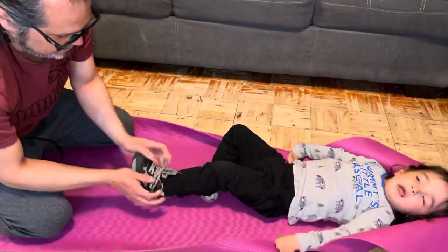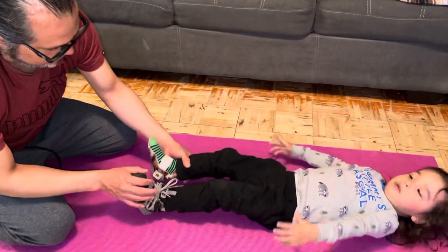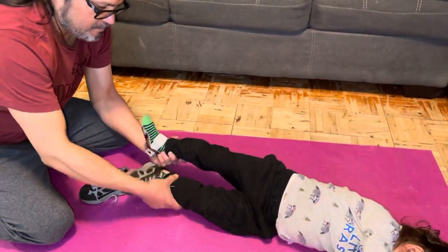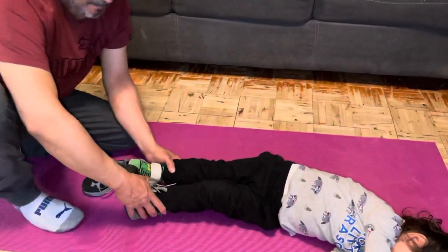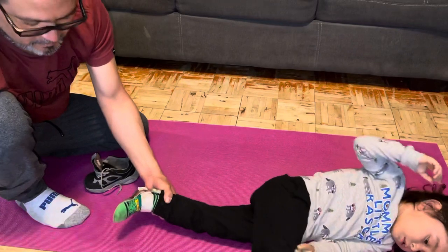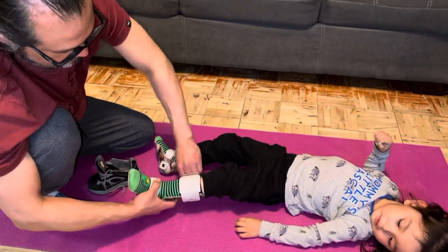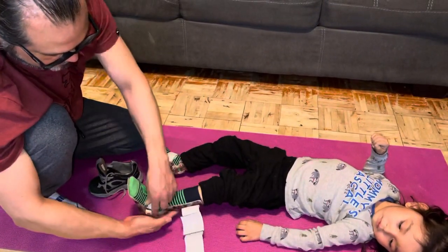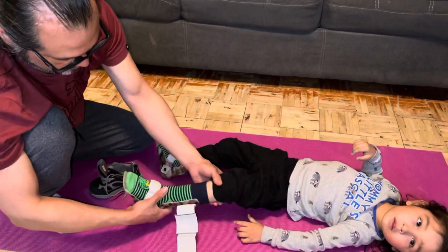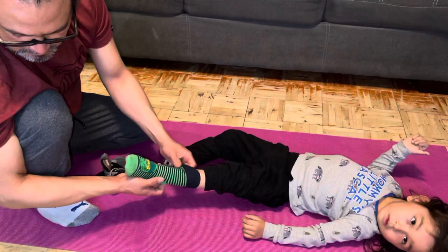Just like that, and that's it. I'll usually double knot it because he likes to pull on his laces. To take it off, his shoe is usually loose enough — you just pull his shoe off like that, and then take off the brace. Sometimes if he's napping he likes to have them off. It's easy to take off.